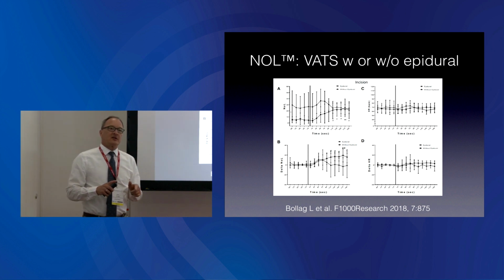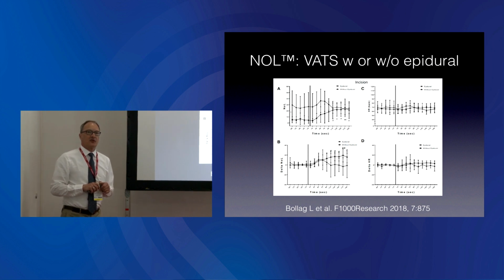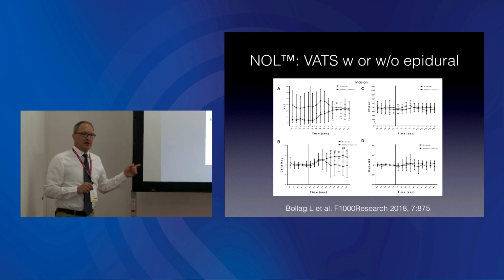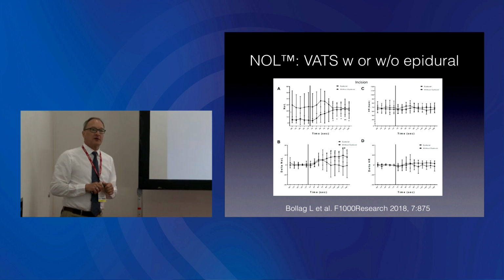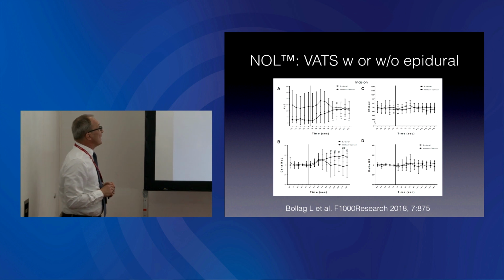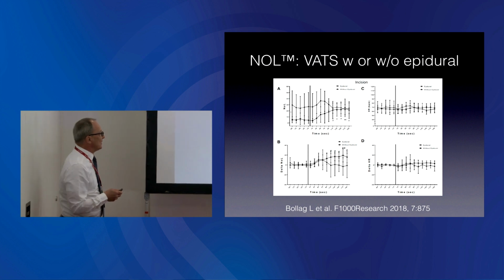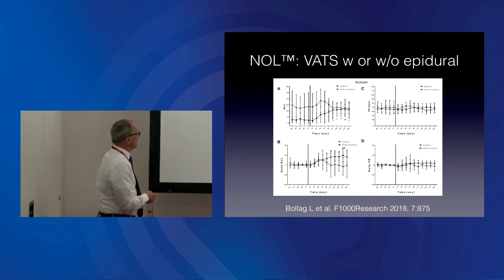When I was preparing for this lecture, I looked at whether there is anything already published on thoracic surgery using the NOL index. And there is indeed a study from Canada that has looked at the comparison of using epidurals versus non-epidurals in terms of the response to various stimuli. This is the response panel against the skin incision. The skin incision is at time 0. The top panel, which is a bit difficult to see, is the epidural group, and below that is the non-epidural group.